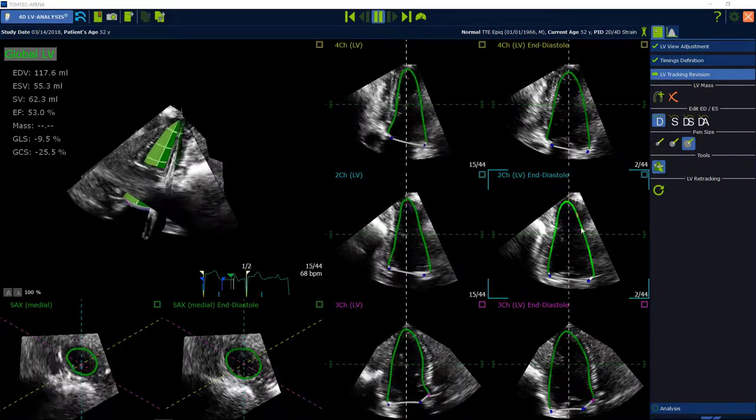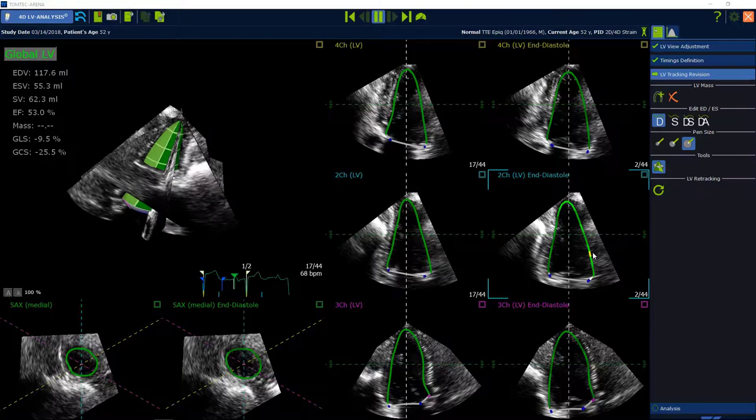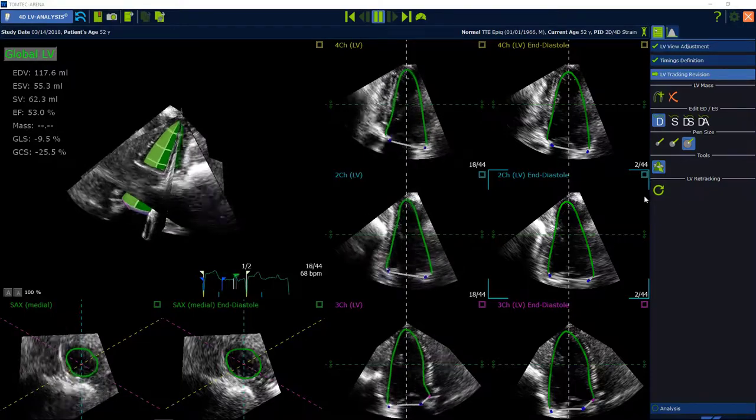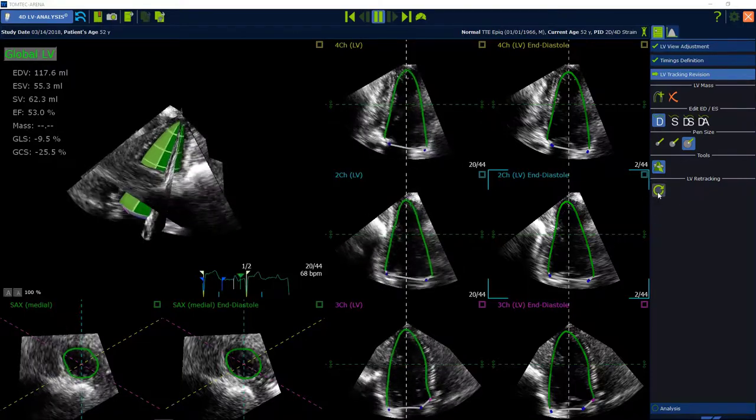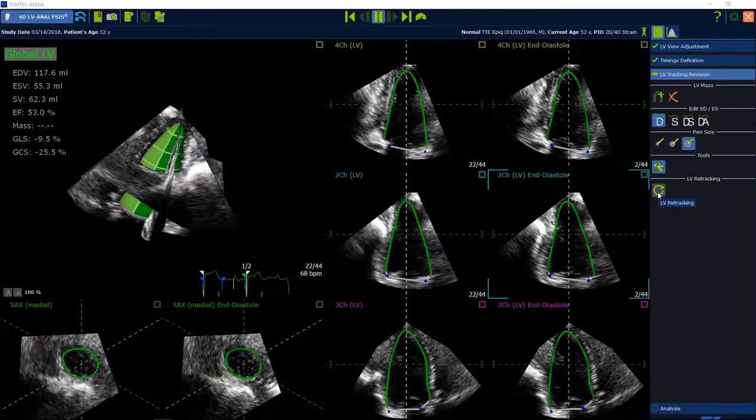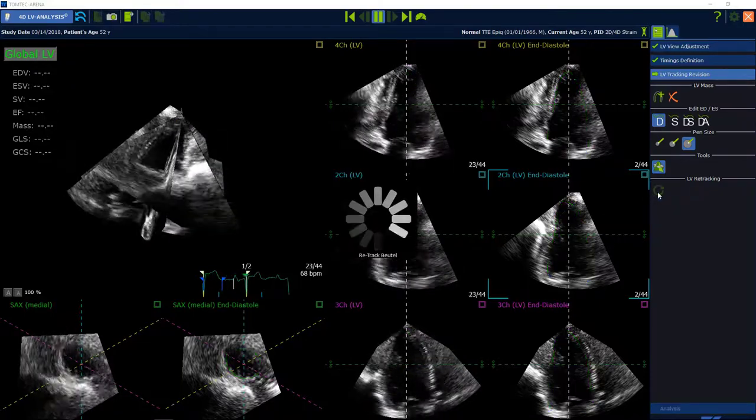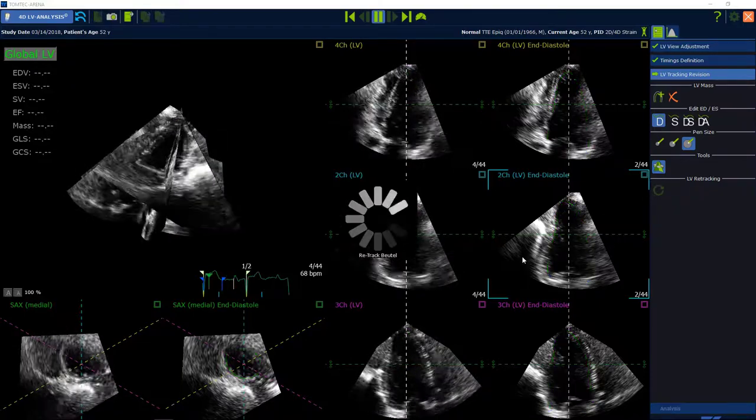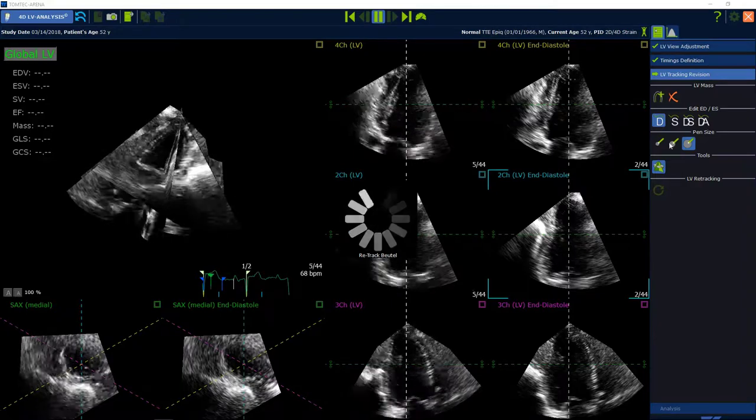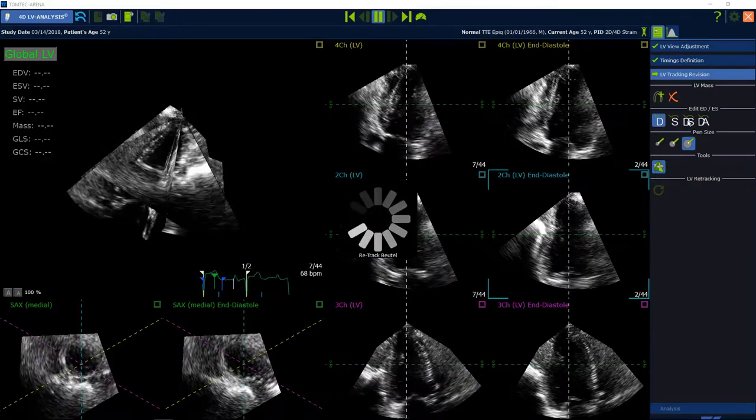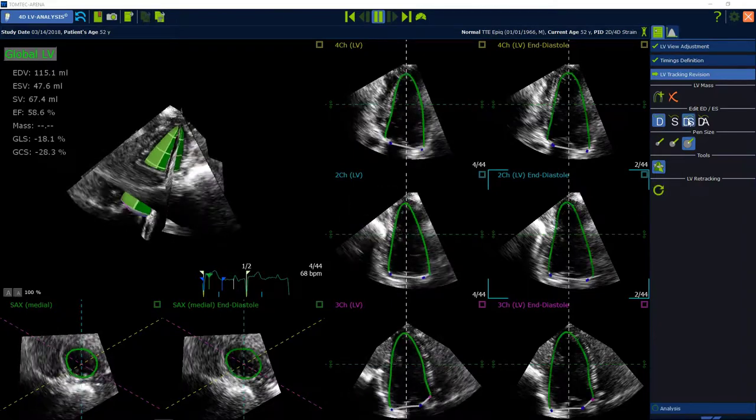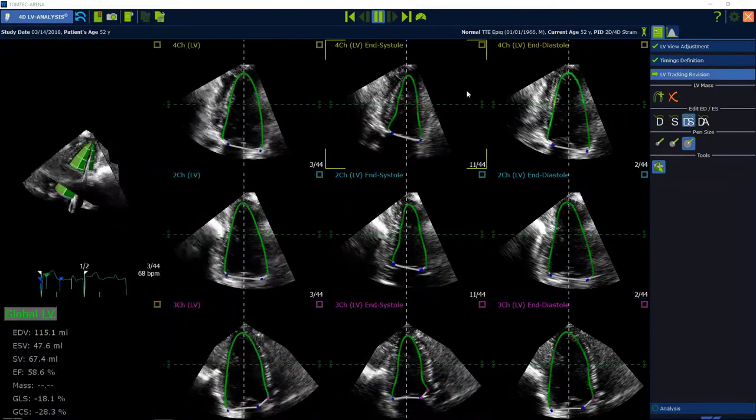When adjustments are done, please click Retrack LV to initialize a new tracking. Make comparison between diastolic and systolic borders and adjust systolic phase if necessary.